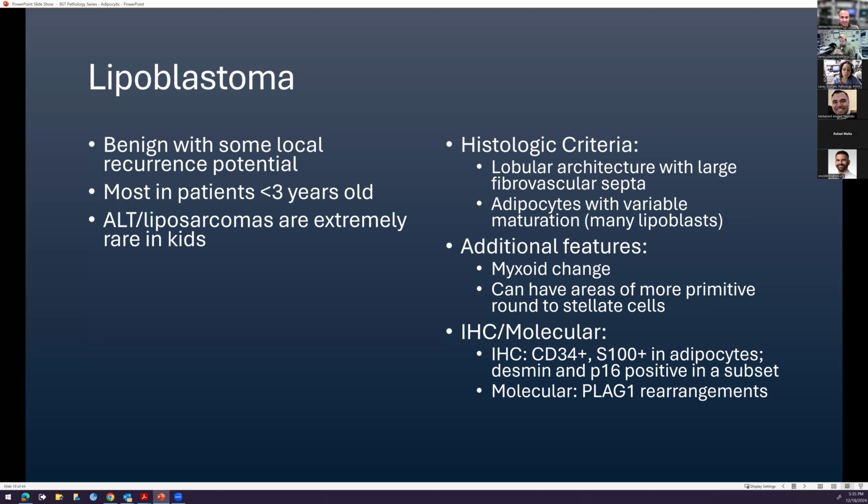Cool. All right, any questions about this PLAG1? Mark, Montgomery, you see this PLAG1 here? Yeah, PLAG1, I got it. Okay, awesome. PLAG1, guys.